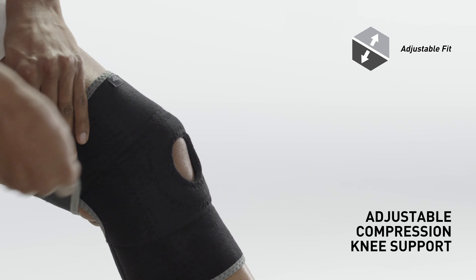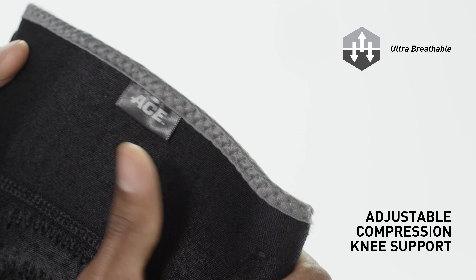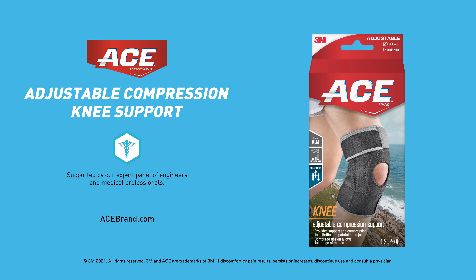Two adjustable straps provide customizable compression and fit. Soft neoprene blend material is breathable to help keep you cool and dry. ACE brand adjustable compression knee support is backed by our expert panel of engineers and medical professionals.